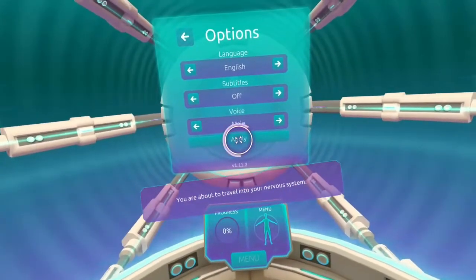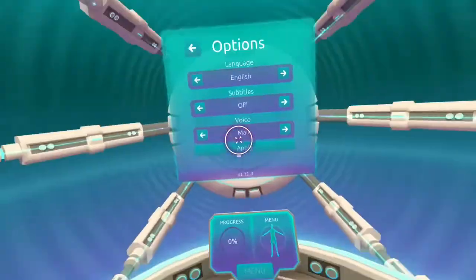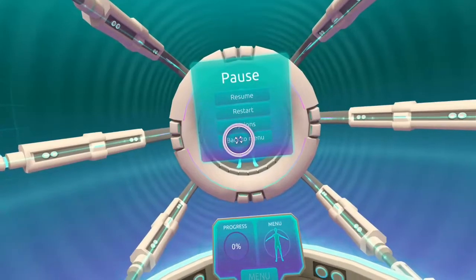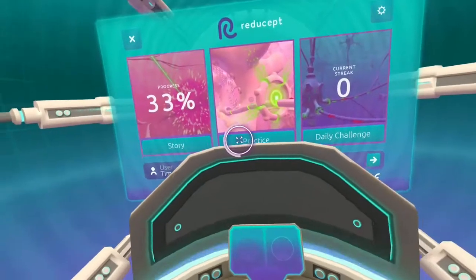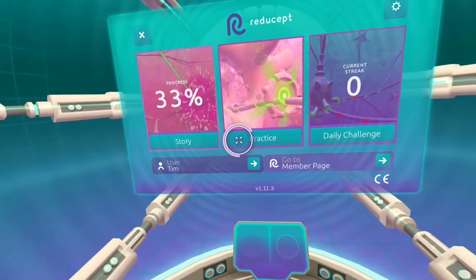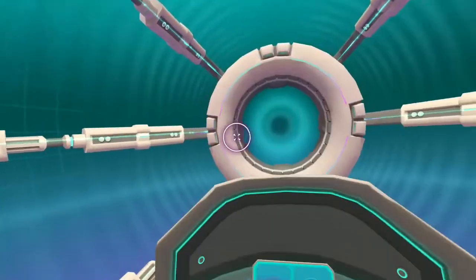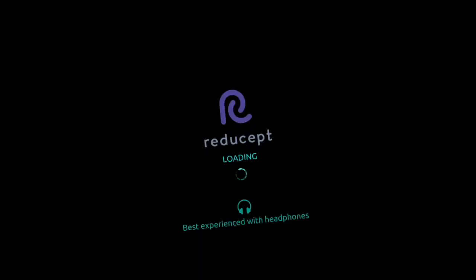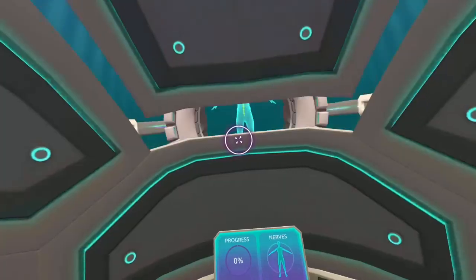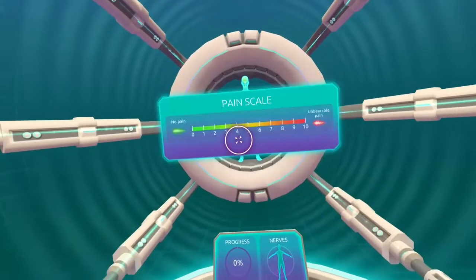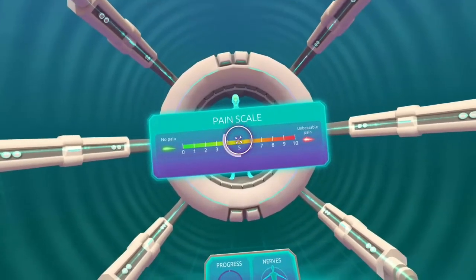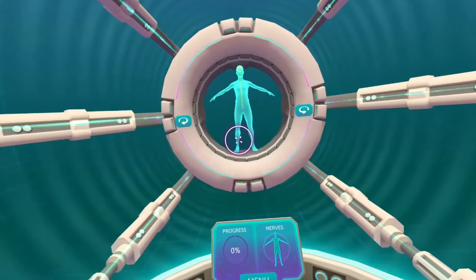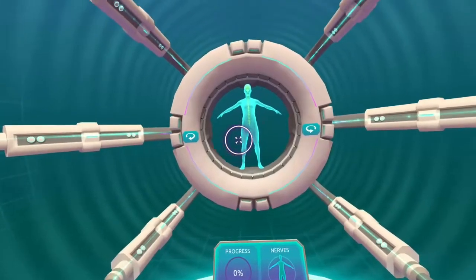Let's assume we already know the basics, and go straight to practicing the nerve level. First, we are asked to rate our pain on a scale from 0 to 10. After that, the game expects us to pick a place on our bodies where we are currently experiencing pain.